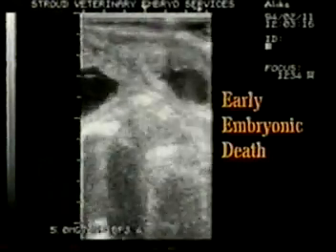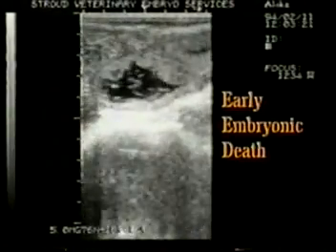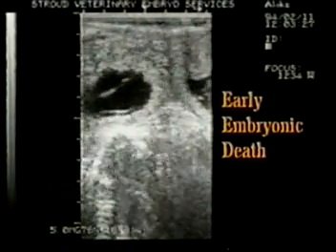When the chorionic membrane has separated from the uterine wall, the growing embryo or fetus cannot survive. Notice how the fetal membranes have pulled away from the uterus and are free floating in the uterine fluids.